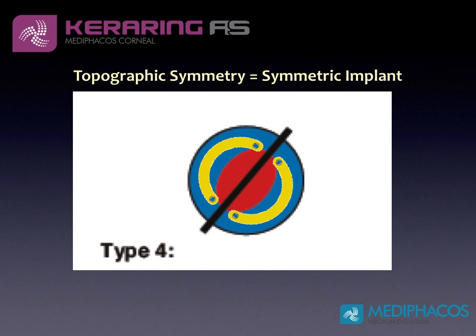Conversely, in cases where we see a more symmetric distribution of the ectatic area, we will also use a symmetric implant strategy by implanting two ring segments of the same thickness and arc length.